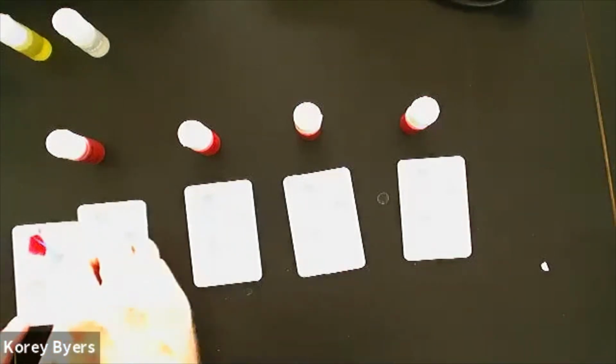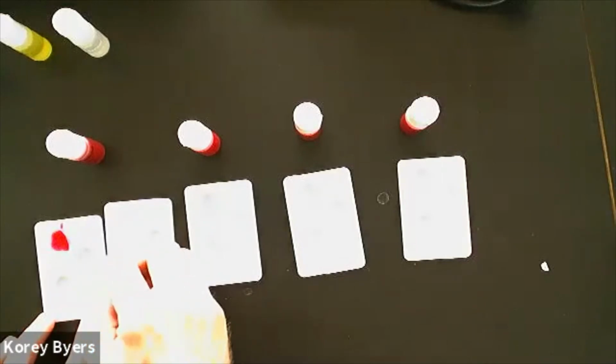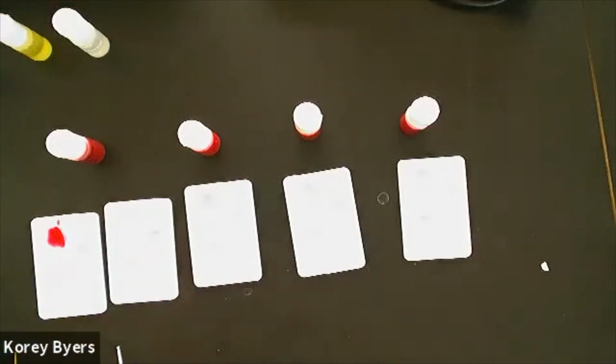Am I on camera? Yeah, there we go. Nothing is really happening. So that means that serum is not interacting with that blood type. So she must not be type A. So down at the bottom of your worksheet, you have a chart with the different names and the blood types on the left. For June, we can put no, or an X, or a 0 where it says type A, or blood A. I just use no.